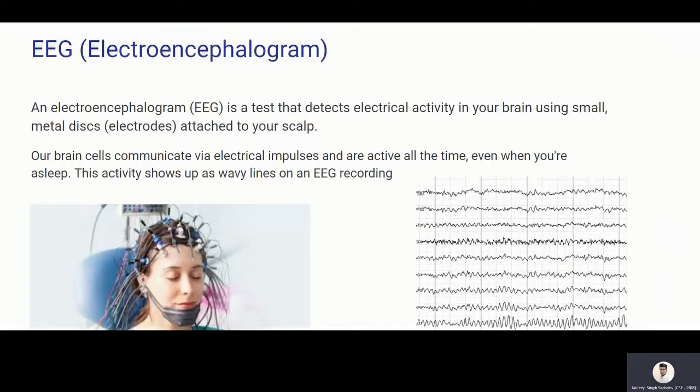These are metal disks and these metal disks record the electrical impulses between our neurons. So you can see that this person is wearing that headset and in the right side, you can see all the electrical readings, all the EEG readings it is recording.